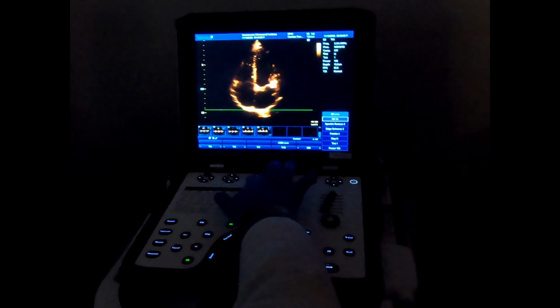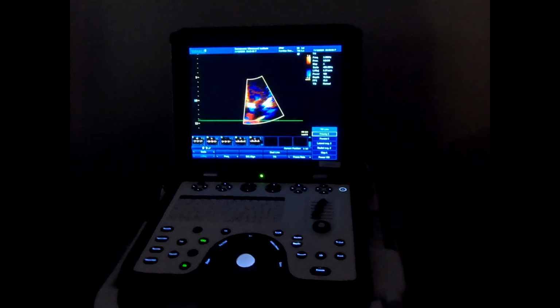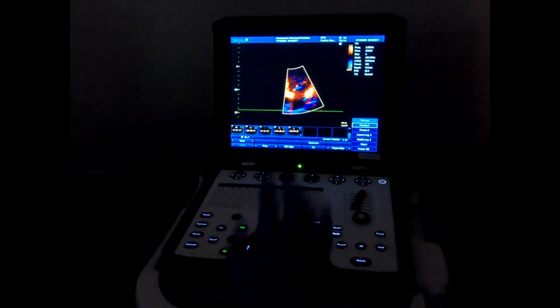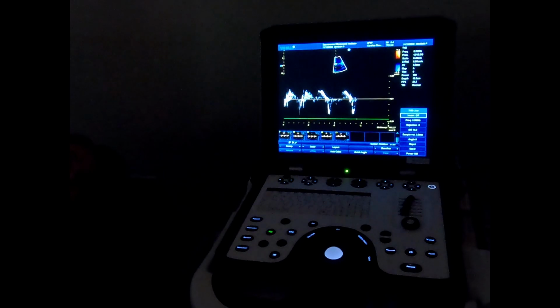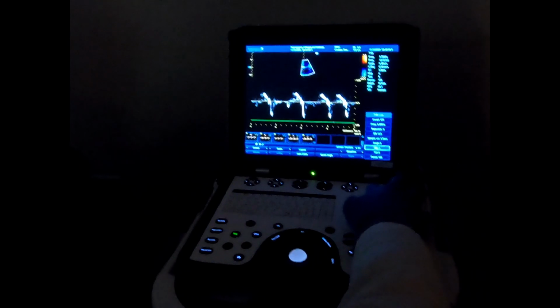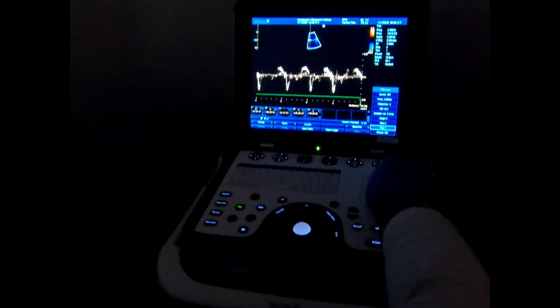And you will get this type of waveform. Wait, what did you do? That's cool. That's crazy. And then pulse wave, a combination of the three keys. Wait, hold on, Alt and then what did you push after Alt? Yes, I will show you again. Let's see the waveform, and I will show you step by step again.